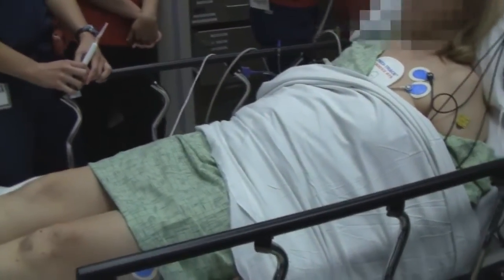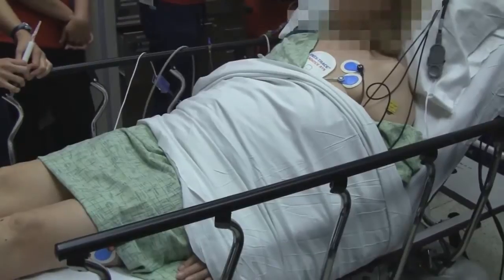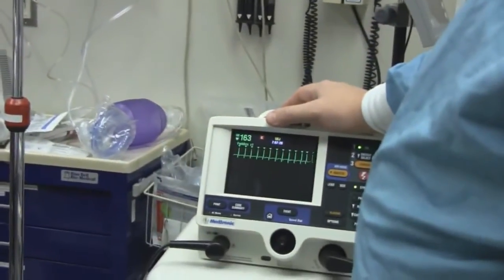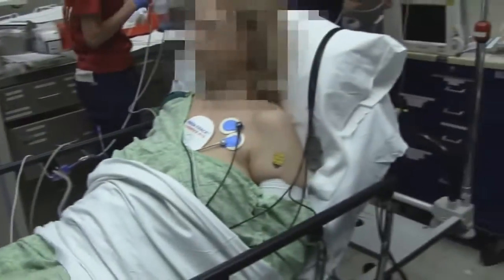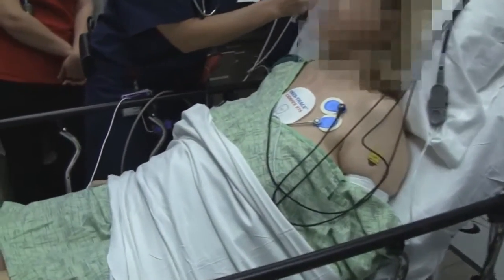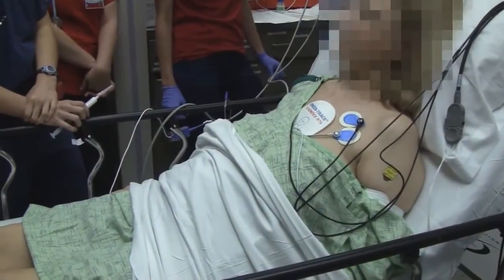You have to make sure the patient hasn't eaten recently. This is an urgent indication — she hasn't eaten since very early this morning. You've got to make sure you have all the appropriate equipment to support her airway nearby when you do deep conscious sedation. Be ready to record her rhythms after she cardioverts to document what her post-cardioversion rhythm is. Sometimes we cardiovert people from atrial fibrillation to atrial flutter and they require more cardioversion. Pad placement here is anterior-posterior; occasionally we'll do side to side, depending on body habitus.